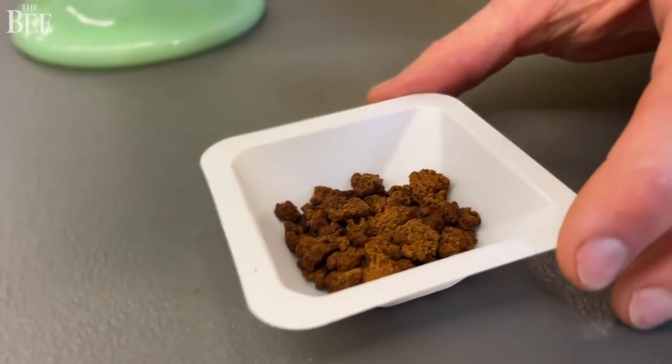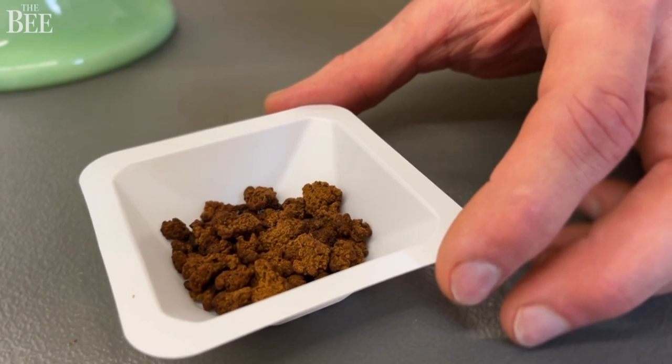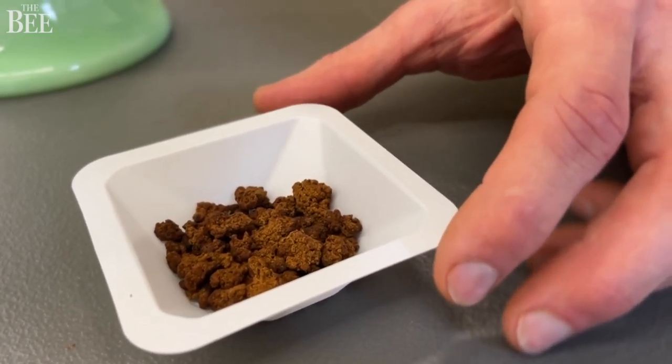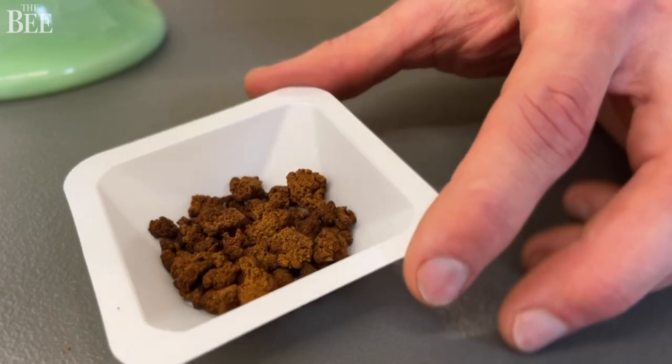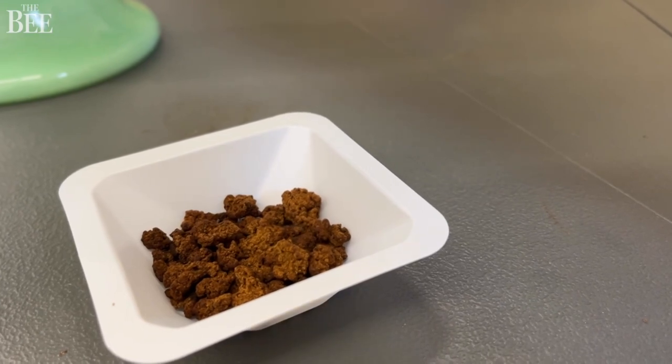This is a cocoa nib equivalent. This is taken from the raw cells that we've cell cultured, and we've applied traditional chocolate making processes such as fermentation and roasting to turn it into a product that goes into the chocolate grinder.